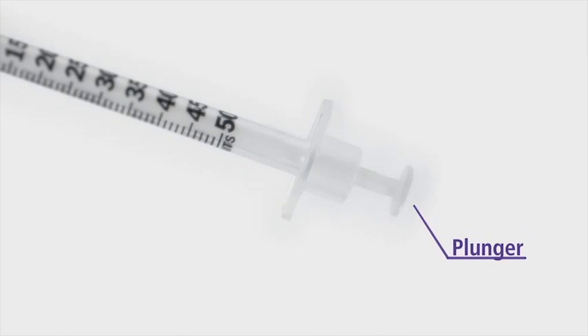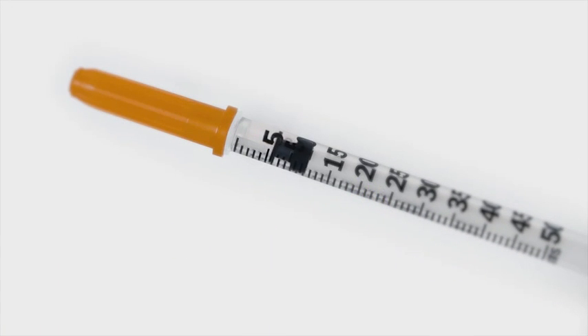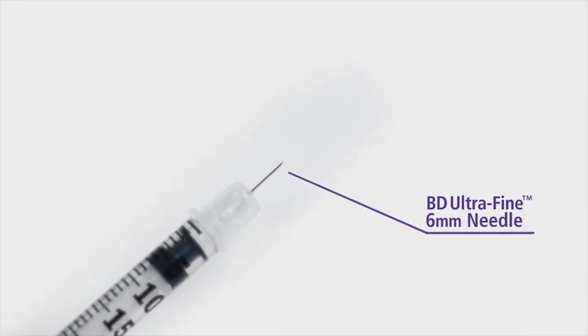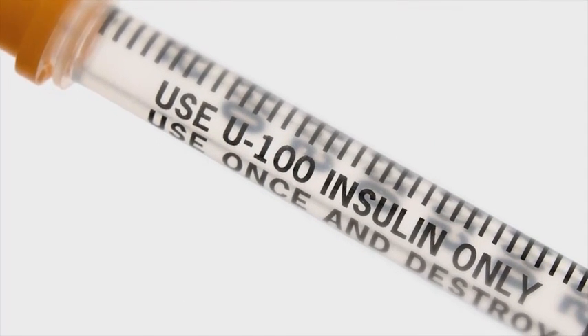A white cap covers the end of the plunger. Inside the barrel, the plunger has a black rubber stopper that moves as you push or pull the plunger. At the other end of the syringe is the needle, which is covered by an orange cap. Make sure your syringe has an orange cap and that the barrel is printed with U100 only. If your syringe doesn't have these features, it's not designed for insulin — unless your doctor tells you otherwise, only use an insulin syringe.